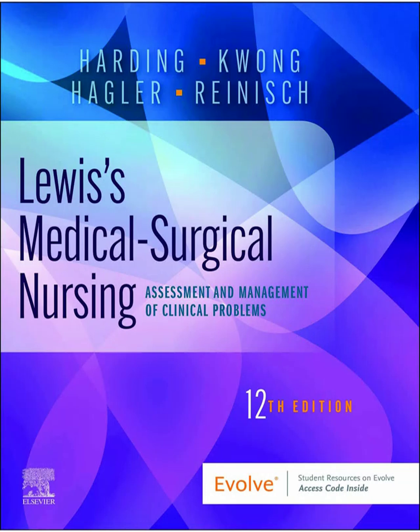First, the P wave. That's atrial depolarization, the atria contracting. Okay. Then the PR interval. That measures the time from the start of the P wave to the start of the QRS. Basically, getting the signal through the AV node, if it's too long.